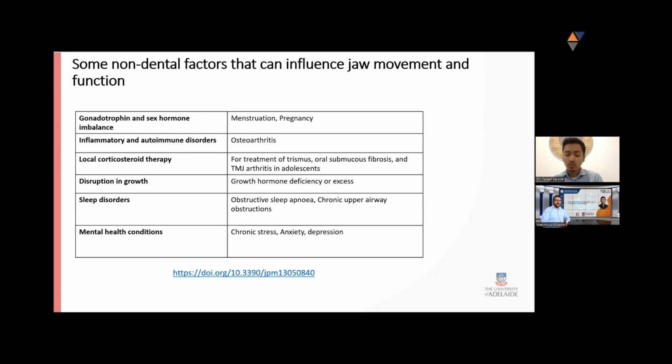Previously, there wasn't any quantitative measures to understand whether this had some basis to it. We would usually attribute this to an increase in maybe inflammatory mediators because of stress, but now we can actually quantify this using digital techniques that can correlate history to the movements directly.